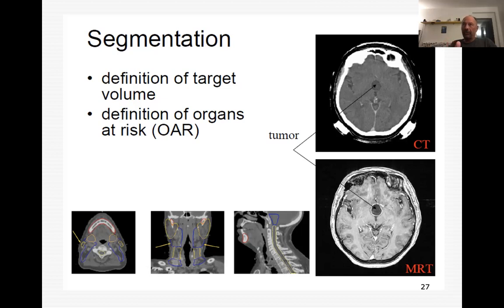automatic segmentation based, however, not on simple software, but more on an artificial intelligence approach, so that the computer does the segmentation. But at the moment, in most cases, this is done not by the medical physicist, but by the radiation oncologist. So the medical physicist only gives the CT to the radiation oncologist. The radiation oncologist makes the segmentation, you see, so segmentation of the target.